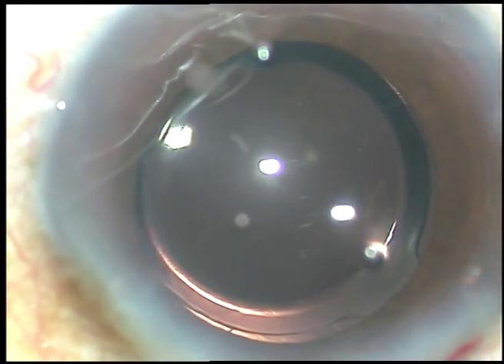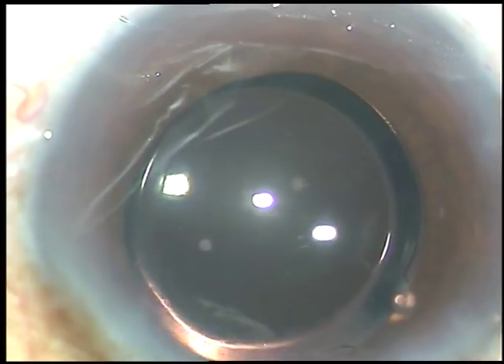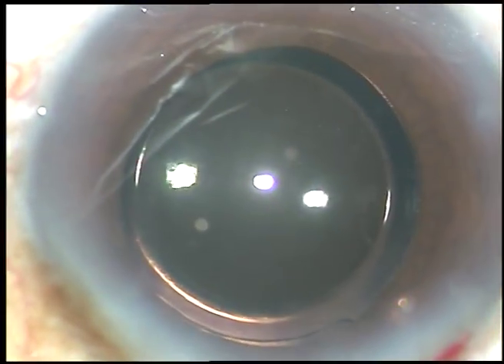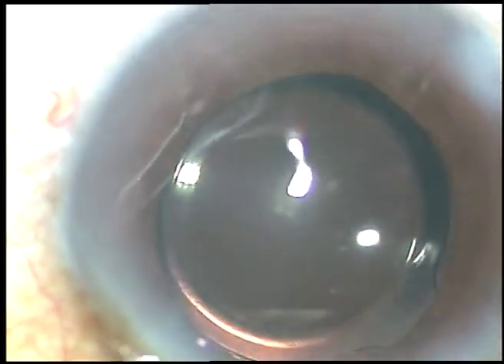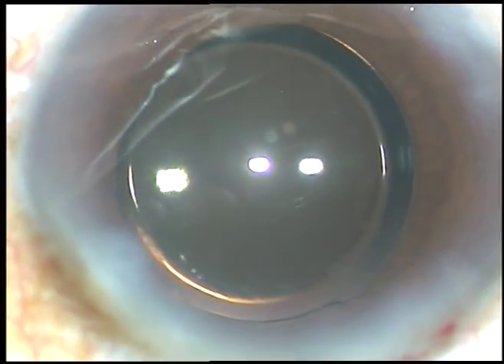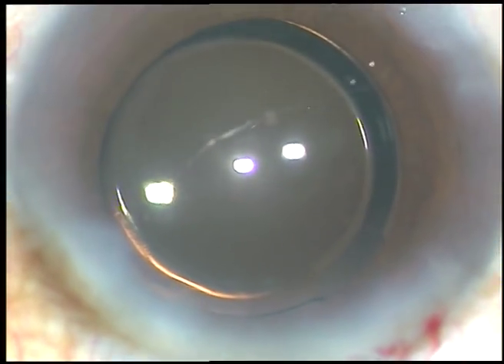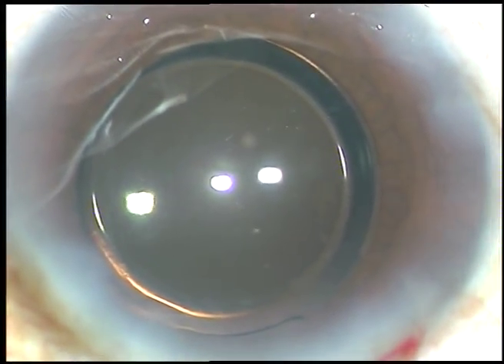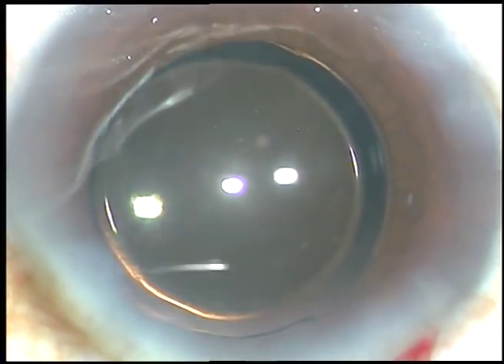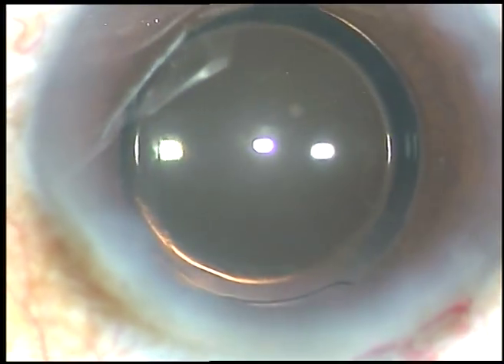Almost 100% of my patients have normal intraocular pressure after surgery — they are very happy. I encourage you to remove viscoelastic substance thoroughly. Now, the side ports are being hydrated; the stroma on either side is hydrated and these incisions close.